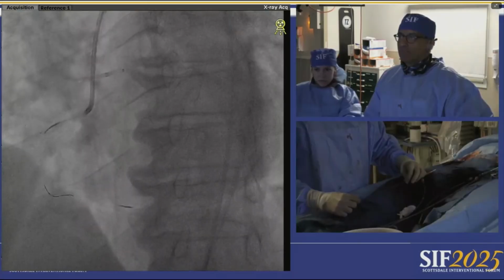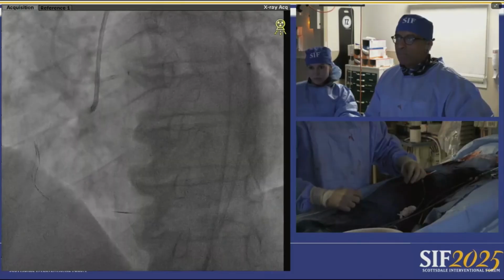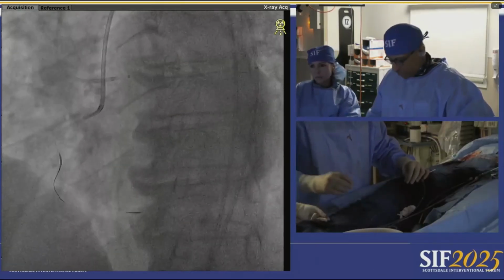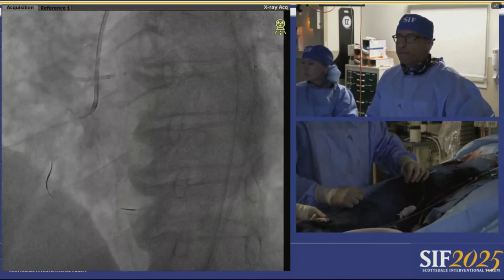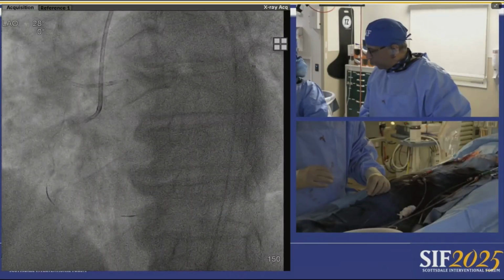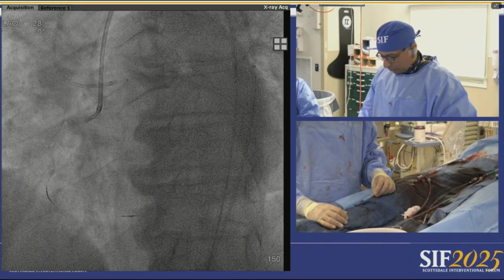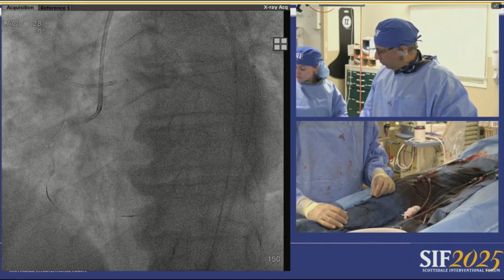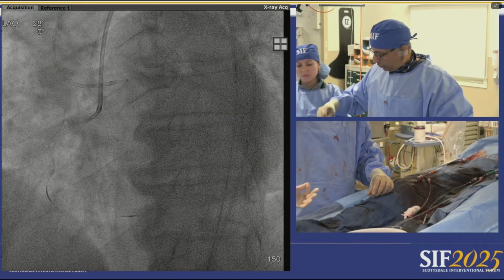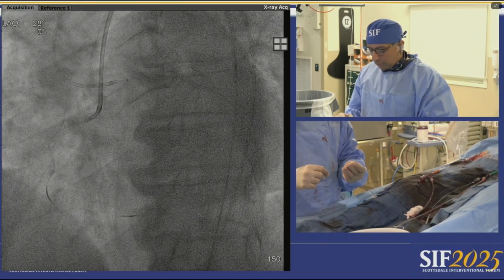Just to add to those excellent comments, I think these are two very different cases when you're talking about hemodynamic support, and you're right. There aren't really great indications to guide us for protected PCI on when we should be using upfront Impella versus just doing the case without. And hemodynamics can guide it, but as you mentioned in this kind of graduate level course of the aortic stenosis and multivessel CAD, what we do have is registry level data for protected PCI, and that suggests that if you use a bailout strategy, outcomes are much, much worse than if you use upfront MCS for a complex case like that with aortic stenosis, left main, and RCA.